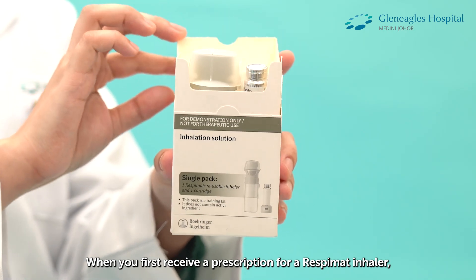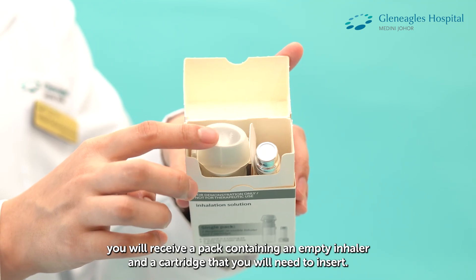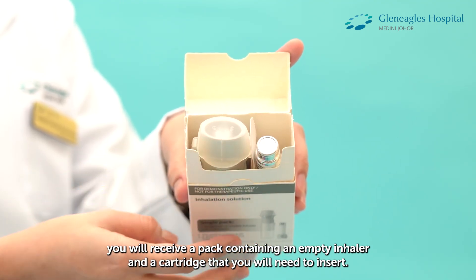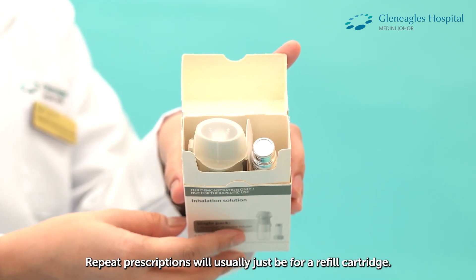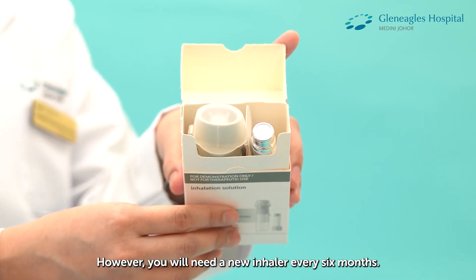When you first receive a prescription for a Respimat inhaler, you will receive a pack containing an empty inhaler and a cartridge that you will need to insert. Repeat prescriptions will usually just be for a refill cartridge. However, you will need a new inhaler every 6 months.